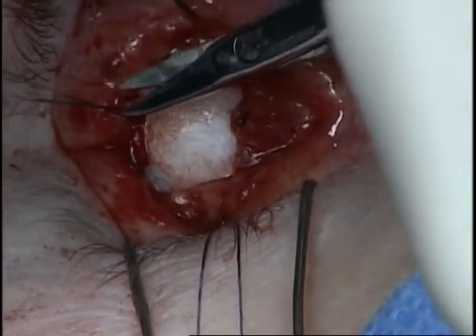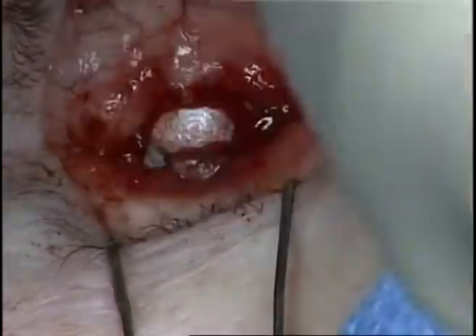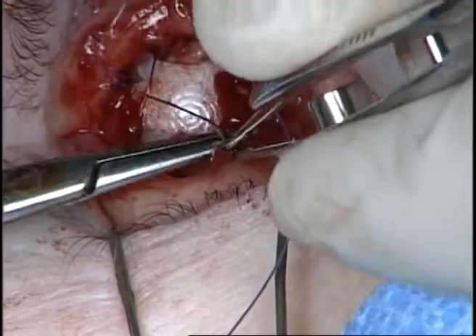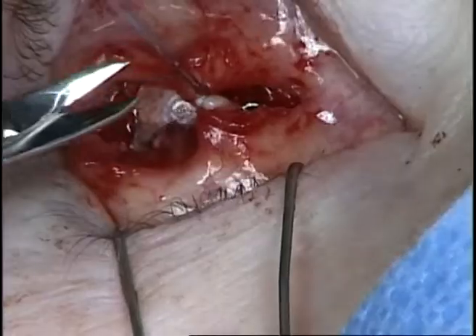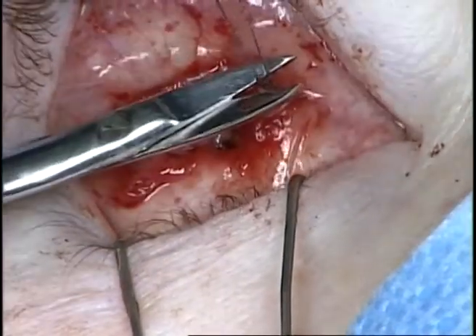After attachment of each of the rectus muscles, the Tenon's capsule is closed. This is performed with 5-0 Vicryl sutures placed in a buried fashion with the knot deep. The closure of the Tenon's capsule is very important to prevent subsequent implant exposure.